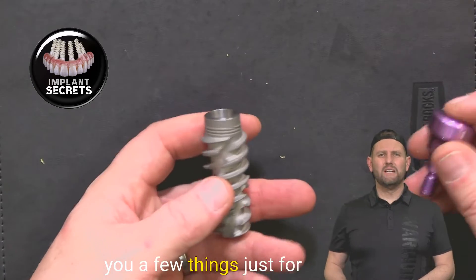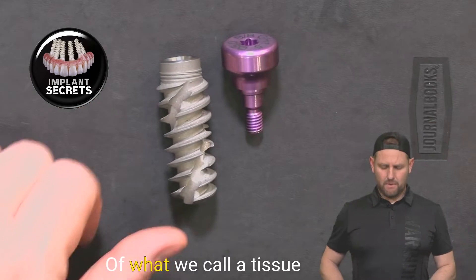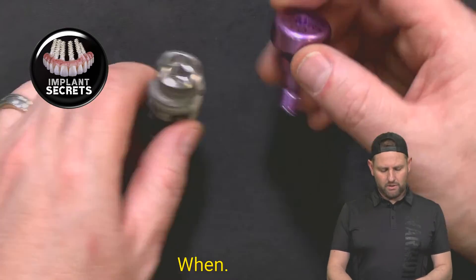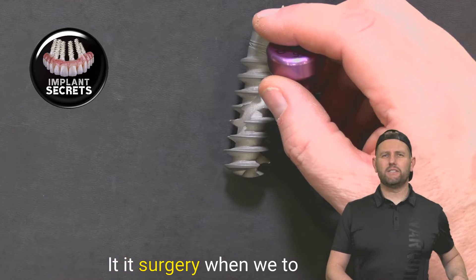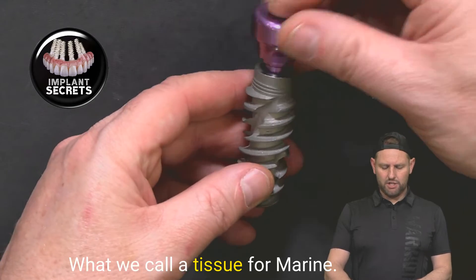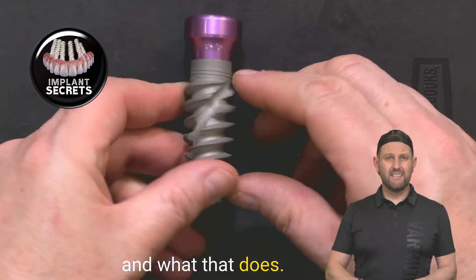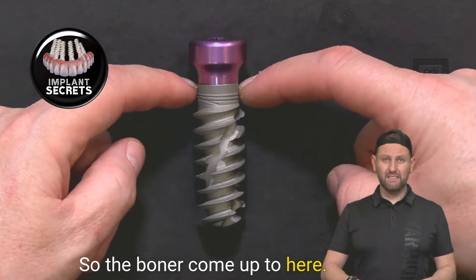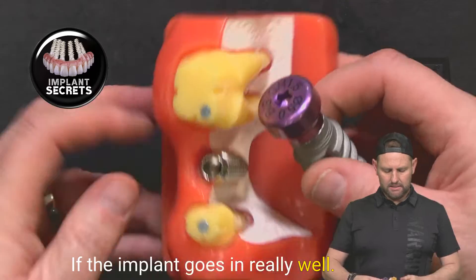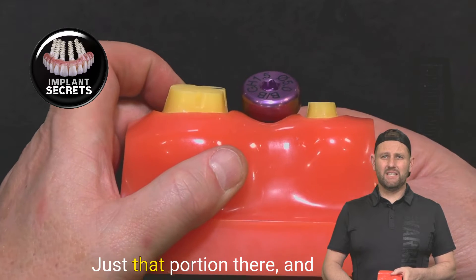Here is an example of what we call a tissue former or healing cap. This is often placed when we place that implant in surgery when we extract — oftentimes we'll place the implant the same day. We put what we call a tissue former in, or a healing abutment. What that does is it goes on top — the bone would come up to here — and if the implant goes in really well, you end up seeing something like this poking up out of the tissue.